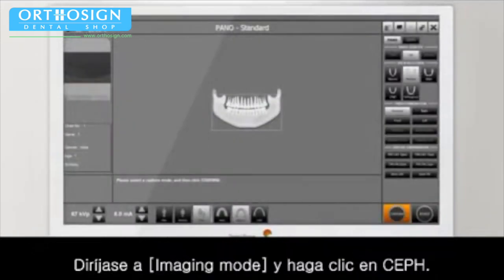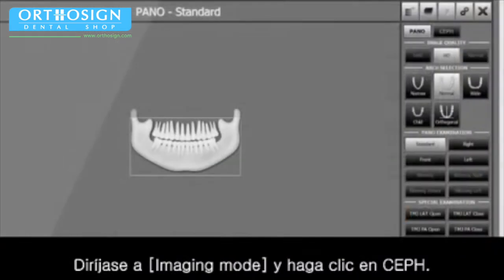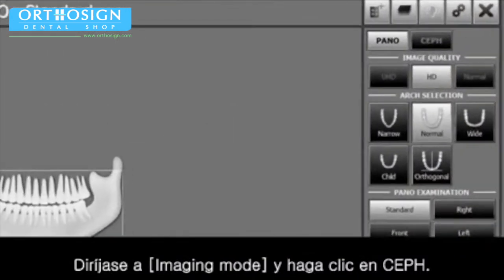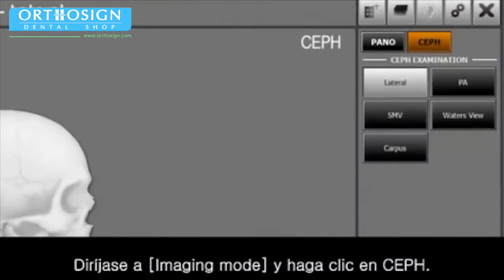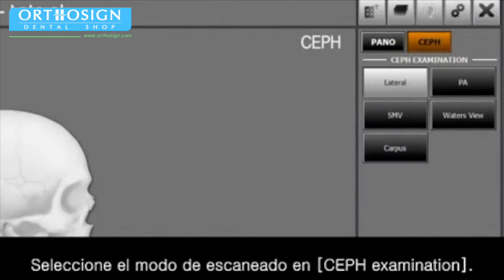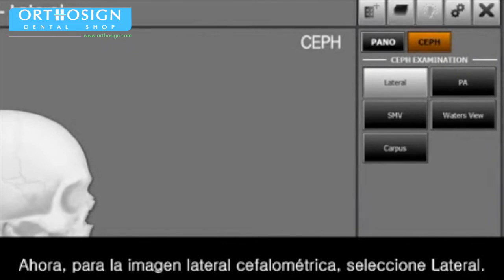Go to Imaging mode and click the Ceph. Select the scanning mode on the Ceph examination. Now for the cephalometric lateral image, please select the lateral.